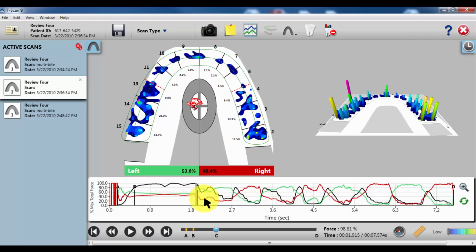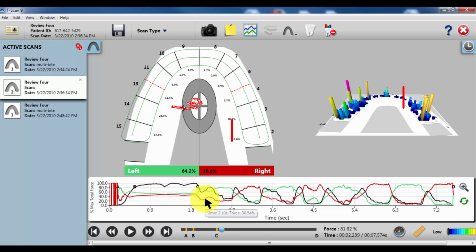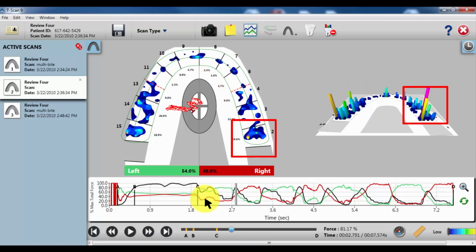But when we go to the C region where they began the movement of crunching and grinding, you can see what happens on tooth number 2 is a pretty high spike. I'm just going to rewind and fast forward here incrementally, but you'll see the colors a lot higher. Earlier it was all green. And so here comes the first or second movement towards 2 during the grind, and it really gets a spike of high force.